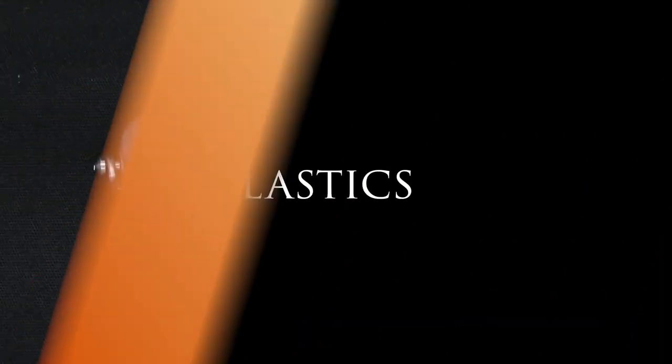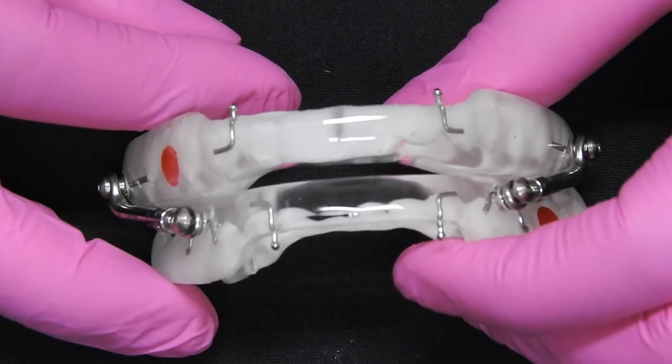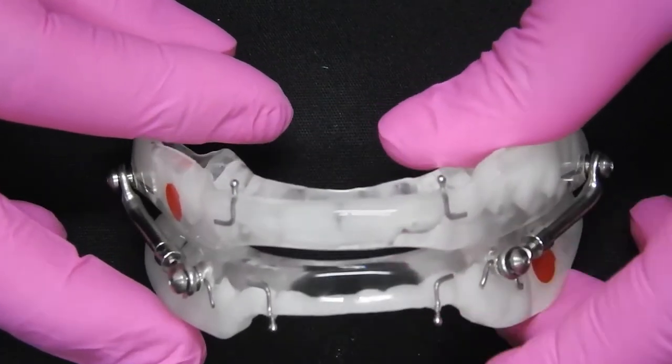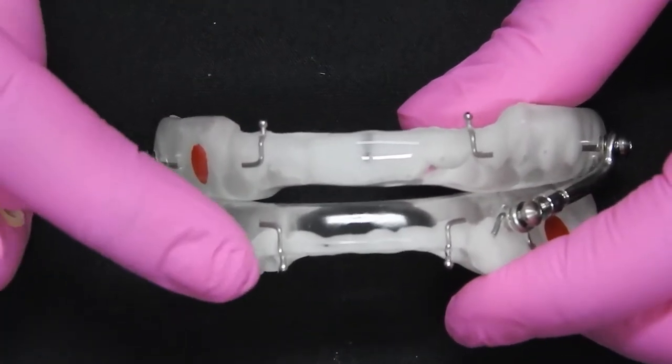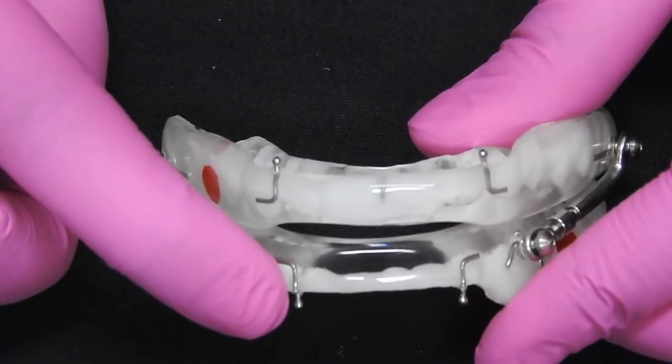Adding elastics to your Dynaflex Herbst. Locate where the elastics will be added on your elastic hooks.